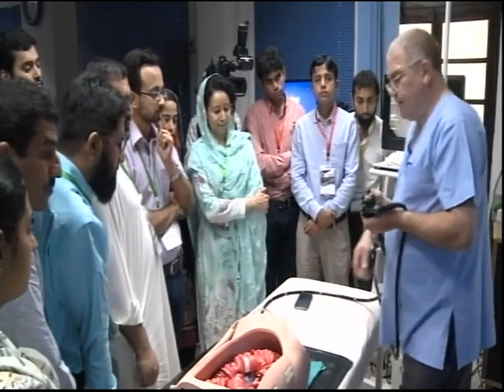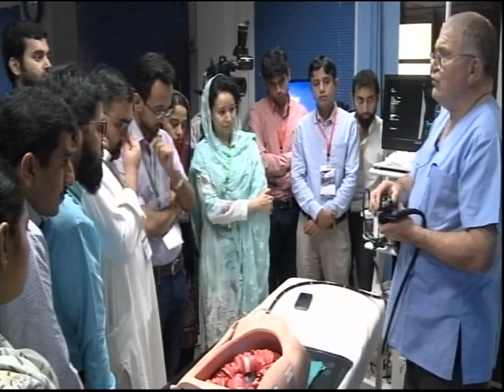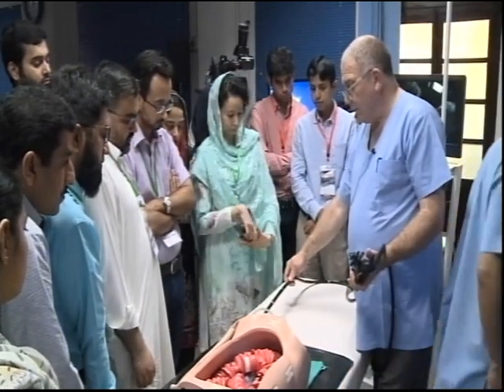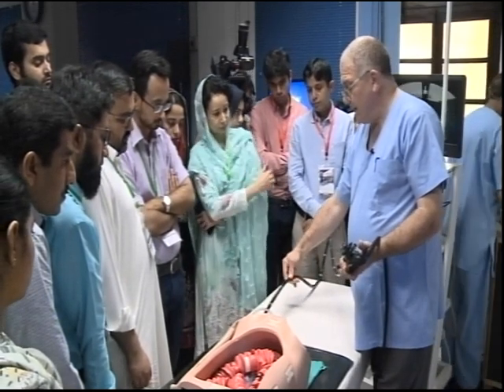So watch the tip of the scope. The tip of the scope is there. This is only just to show you what's happening. What she was trying to do was put torque on the scope. Can you see? And the torque couldn't come on. Look at it. I can make it do.